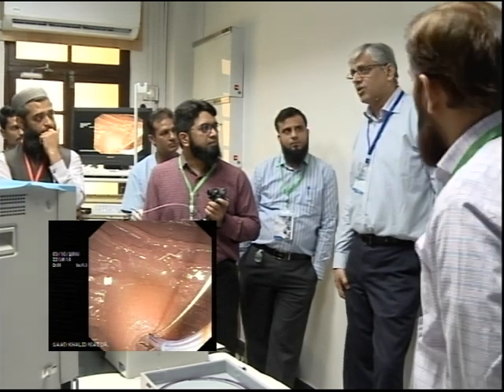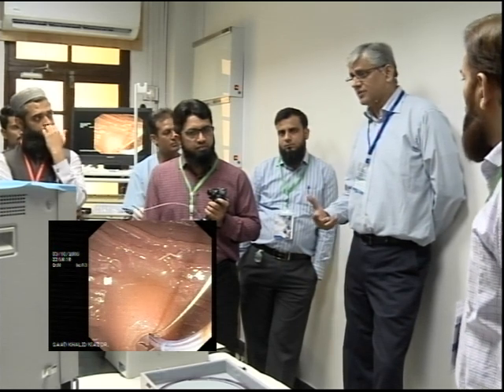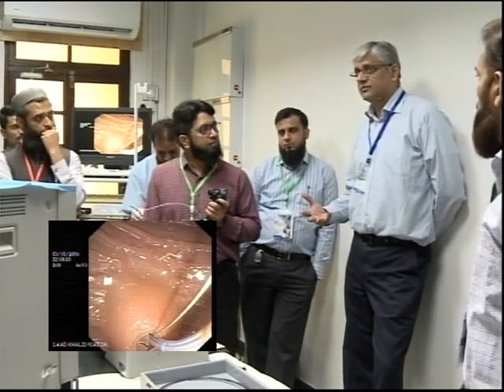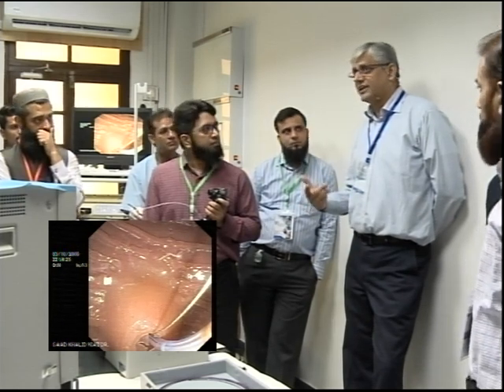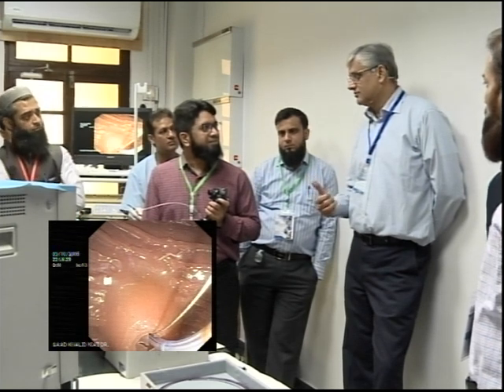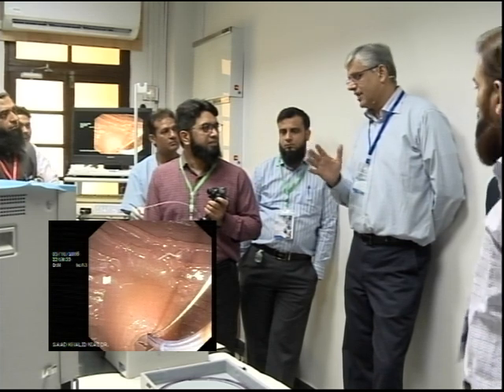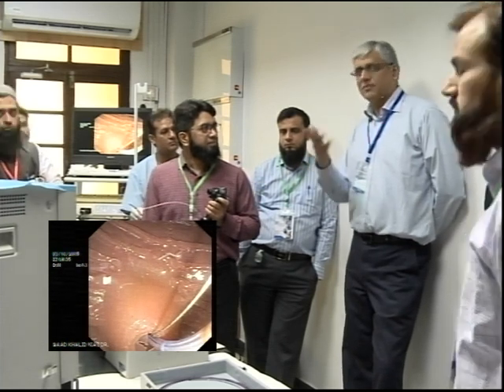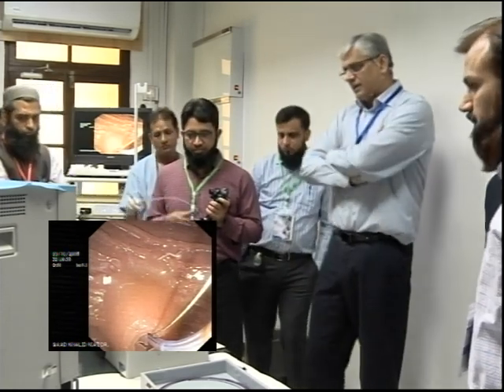What is very important is, when you're suspecting pancreatitis, in our practice, we push in fluids. The moment you have that, that's very important. So I'll tell my anesthetist, yeah, I'm not happy, push in some fluids. Even though pancreatitis is waktak to nahi pata hota, but you have an idea. Quite often, jab aap samajhte ho, nahi hota, jab nahi samajhte ho, ho jata hai. So come back again and try again.